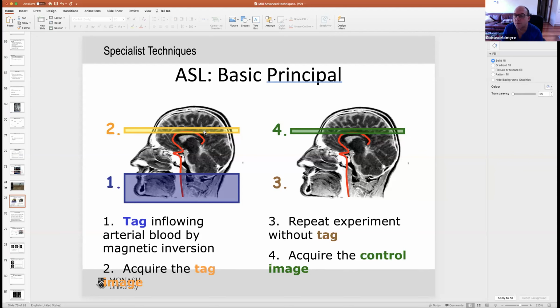And we know, hopefully, we've seen perfusion in CT and maybe MRI. So the faster the pulses come up, and then we do a number of tags and listen, tags and listen, tags and listen. If the blood comes into this region with a delay, then it means there's going to be a pathology, or some sort of delay causing that blood going to the perfusion. We say pathology, a tumor, for example. The blood will get to the rest of the brain, but to the tumor it will be a lot slower. So if we can see that the tagged blood down here gets to a tumor that's in this slice slower, or takes longer, it will be tagged later than the healthy tissue.